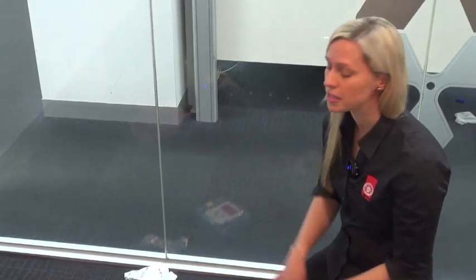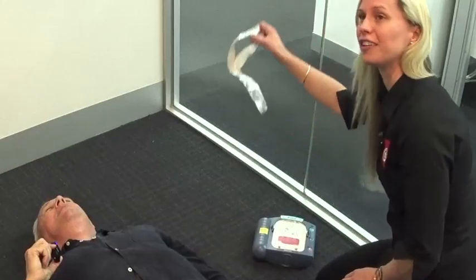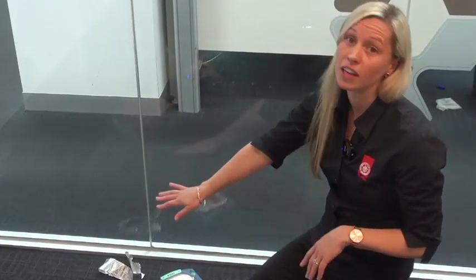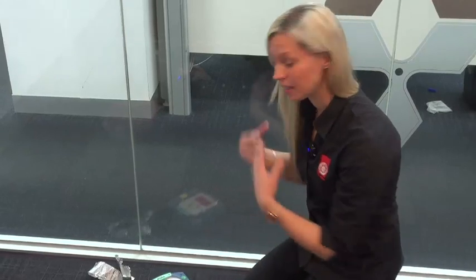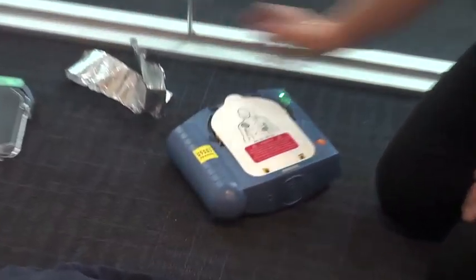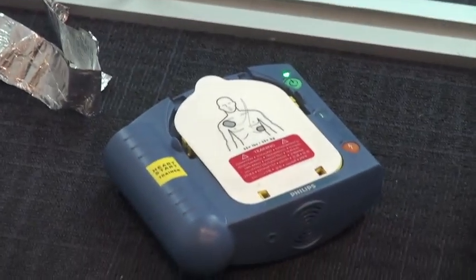While that's happening, I'm now going to put the defibrillator onto the person. It simply says 'pull' — we're going to pull the handle and follow the prompts. Because we're just a training setup today, I'm going to put a little bit of alfoil across John's body so that it'll actually pick up that it's on something and run through the drill, but in real life you do not need that alfoil. CPR is happening and now I'm going to apply the defib.